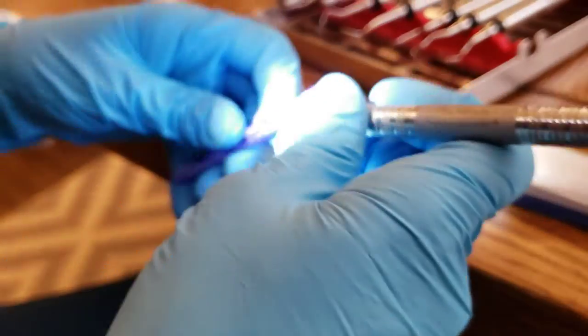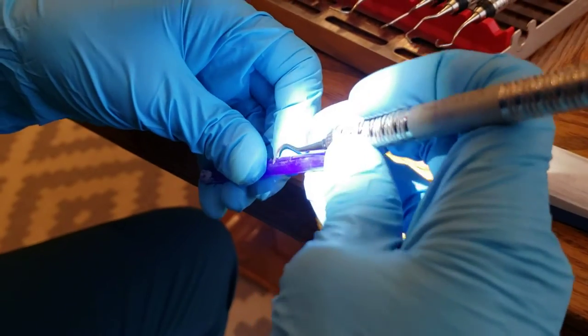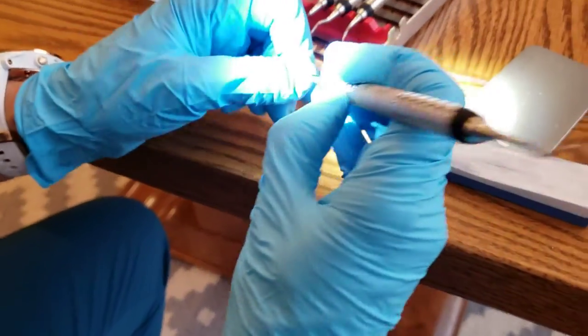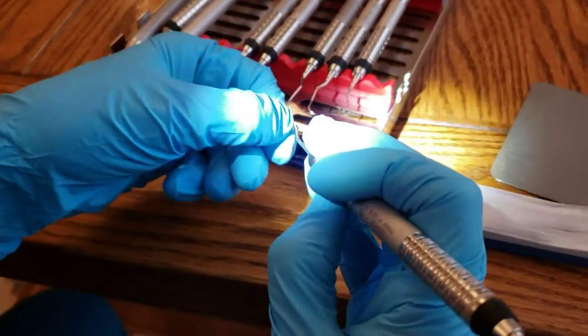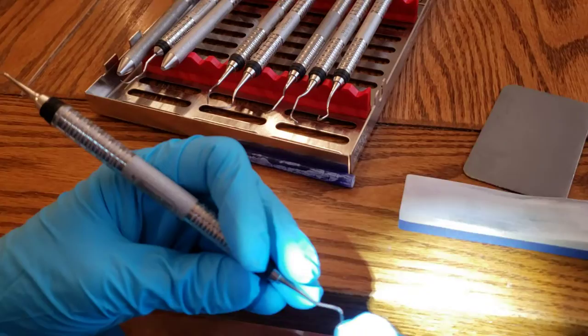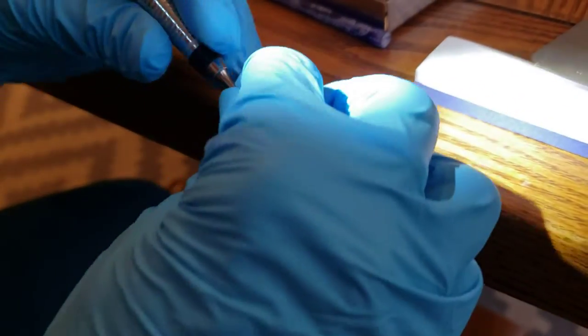And then we can check it, and it grabs right along. So that is your 6-7. That's an anterior sickle scaler. I'm going to do another universal, which this is a 204S. Some people, you may not be familiar with the 204S. It's kind of, you would sharpen it the same way as like your Barnhart. But it is a sickle. So we are going to go off the end instead of around the edge, like I'll show you on a curette.